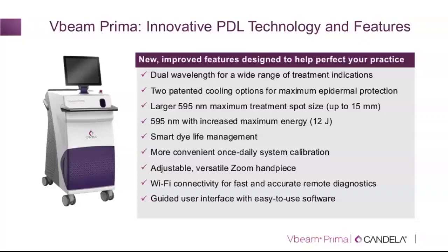There are some questions about settings. In terms of the settings, the interface, or the guided user mode, is available in the Vbeam Prima with both the 595 as well as the 1064. So for both the pulsed dye laser as well as the Nd:YAG, there is an interface-guided use where there's a drop-down menu, you can choose different applications, and it gives you the setting to be used. I have checked this, and I'm very impressed with the settings, as well as the expanded application settings from the Vbeam Perfecta, such as, for example, for dyschromias and post-injection bruising. So the settings are there, and they are available in the guided mode.